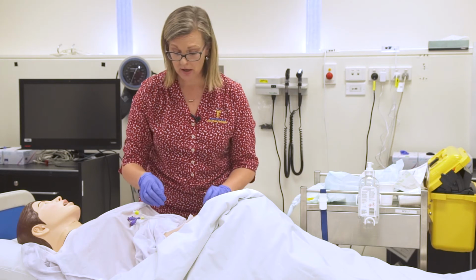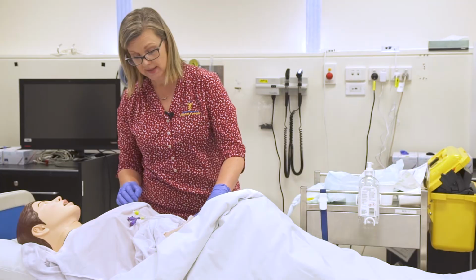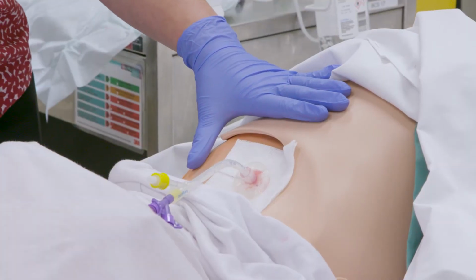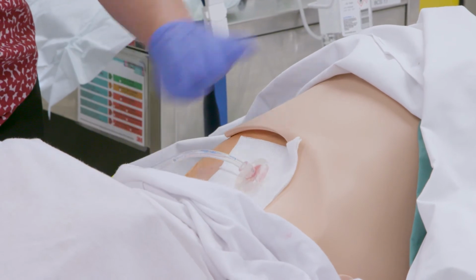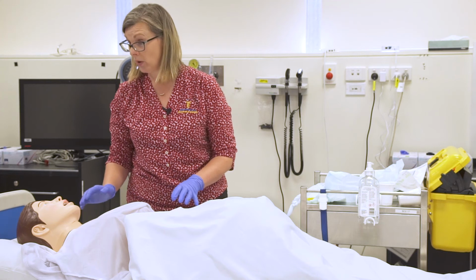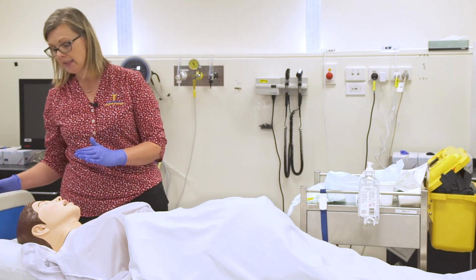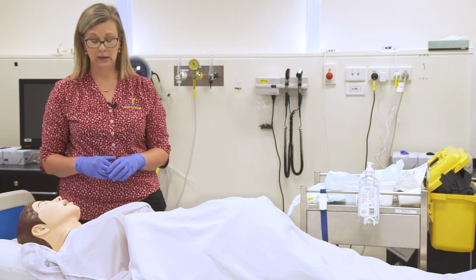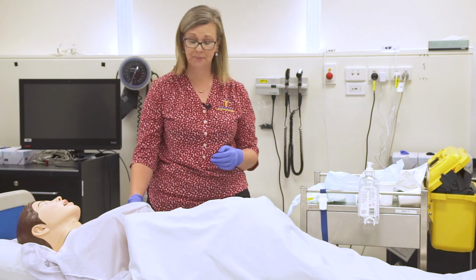At the same time, having a look, making sure that there's no pain on the site, doing a bit of inspection, asking Mary how's things going. She doesn't have any pain, any discomfort with that tube, ensuring that she covers up. An important point when you're giving medications through a PEG tube is that the bed is elevated to a 30-degree angle, and that assists to minimise any discomfort for Mary.